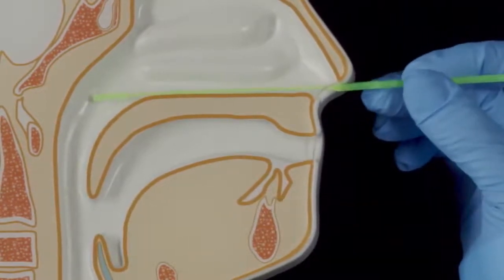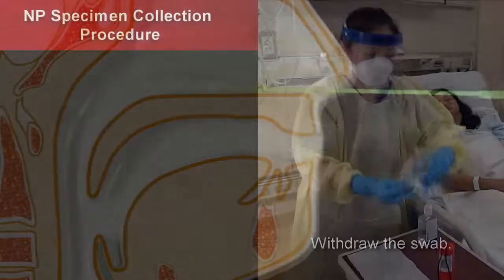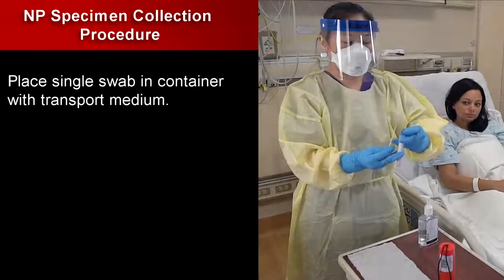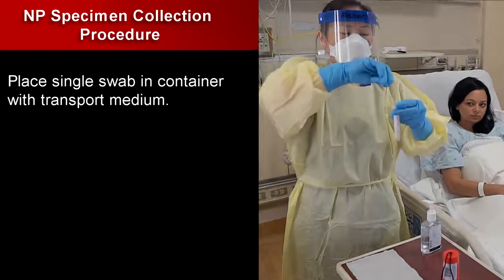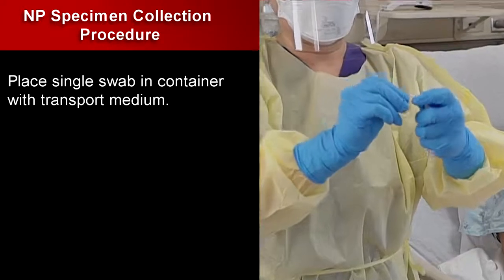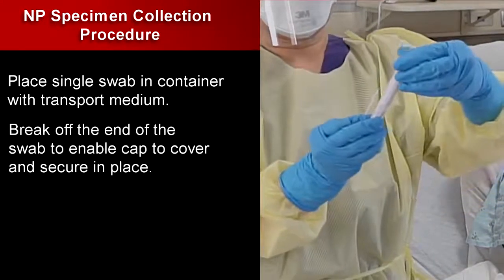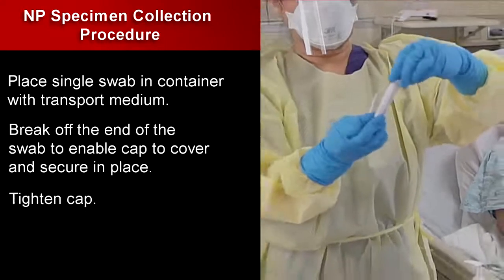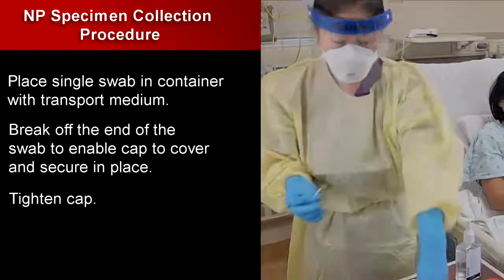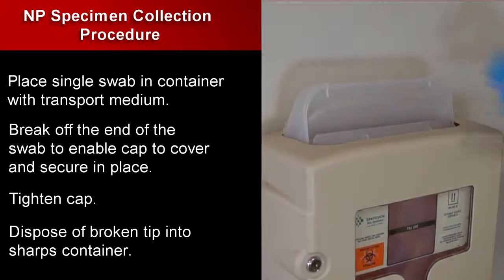Rotate the swab a few times to collect the cells. Withdraw the swab. Place single swab in container with transport medium. Break off the end of the swab to enable cap to cover and secure in place. Tighten the cap. Dispose of the broken tip into sharps container.